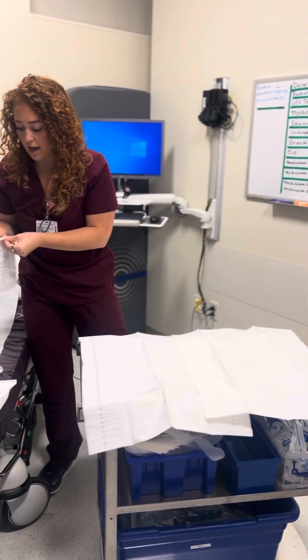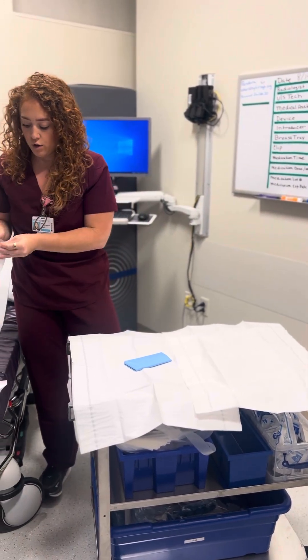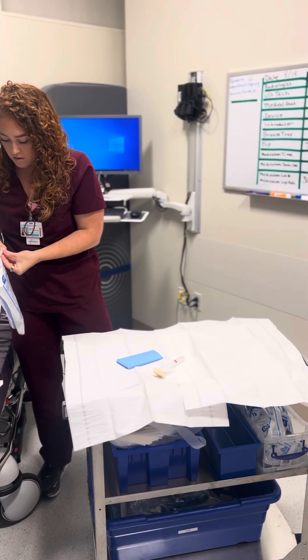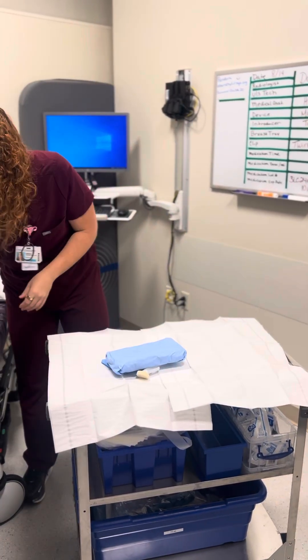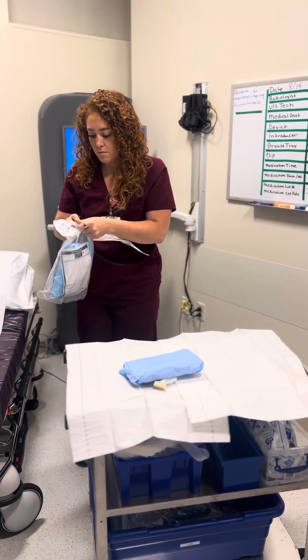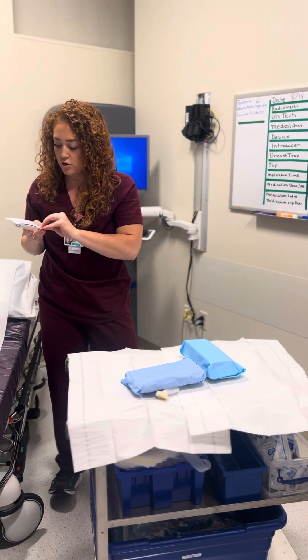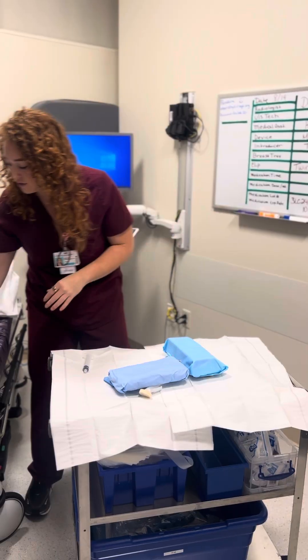Now I'm going to start dropping all of my supplies. I have my probe cover, my chloroprep, my surgical drapes, my breast biopsy tray, my 20 cc syringe, and my 10 cc syringe.